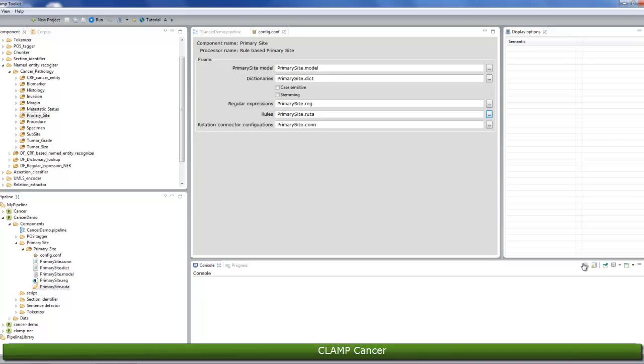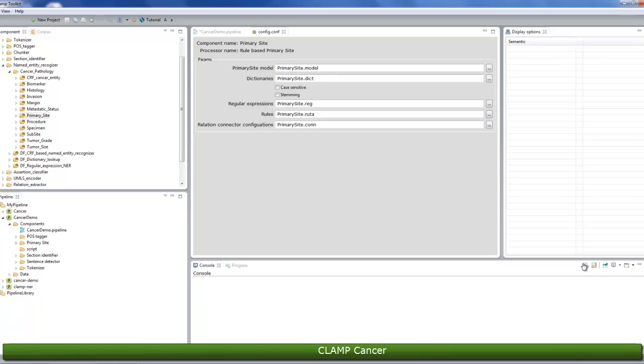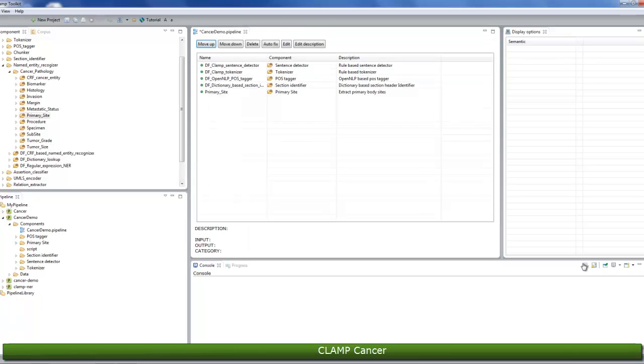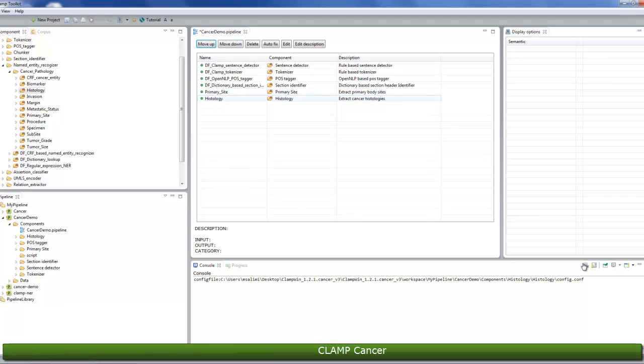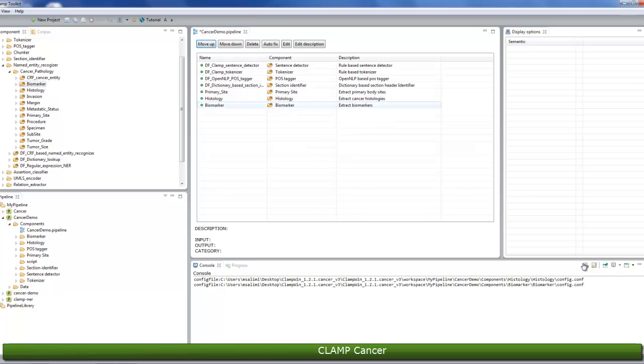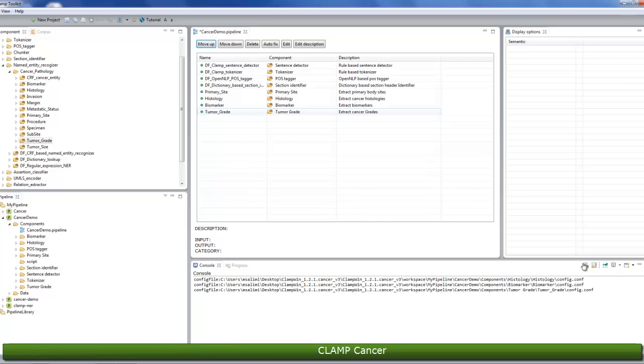We'll go ahead with the default parameters. Now, let's add histology, biomarker, and tumor grade components to the pipeline. Similar to the primary site component, you can choose the default parameters or you can modify the settings based on your needs.